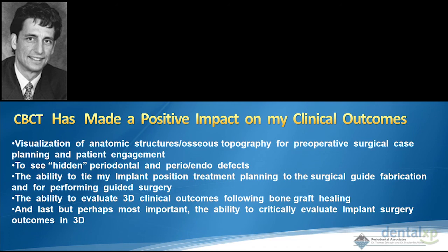And so one of the things that you can do is utilize someone who does have a CT scanner. We open our office to others, and they send their patients over to us. We just take the CT scan. So I think it's something that's critical to include in your treatment planning. It allows us to tie your implant position treatment planning to the surgical guide, either with guided surgery or without. You can evaluate in 3 dimensions your clinical outcomes following your bone grafting.